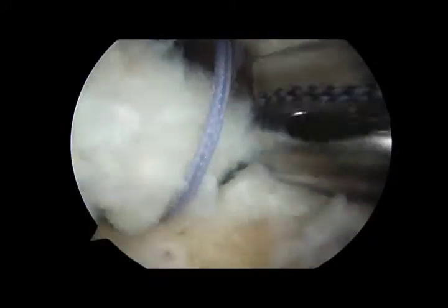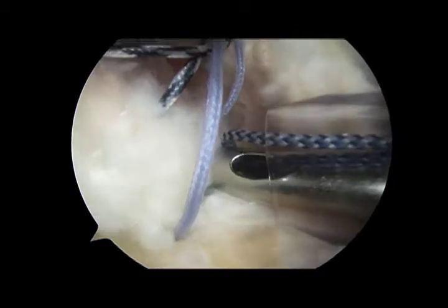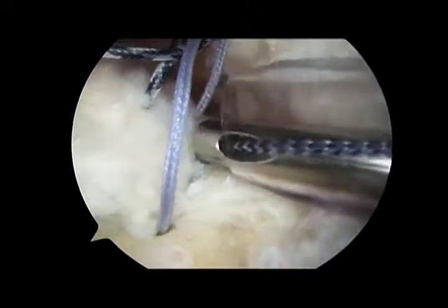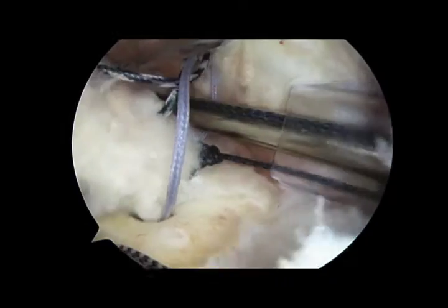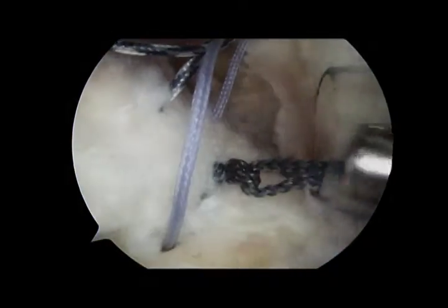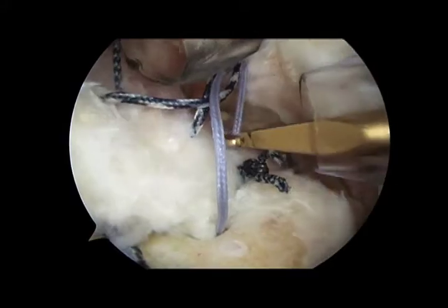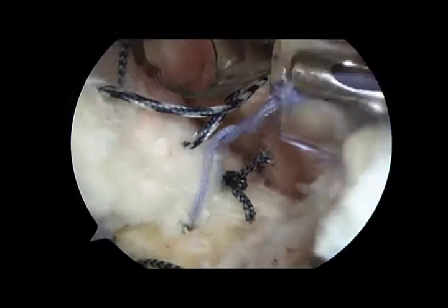Once we are satisfied, the knot is locked while maintaining firm tension between the knot pusher and the post. Then, without reducing tension, we pass point with our knot pusher to further secure the knot. We then back up each knot with 3 half hitches on alternating posts. Both limbs from the middle suture are then retrieved at the anterior cannula and tied in the same fashion.